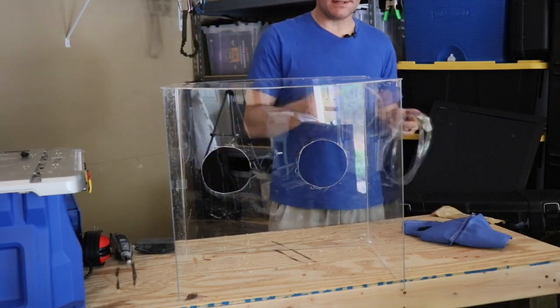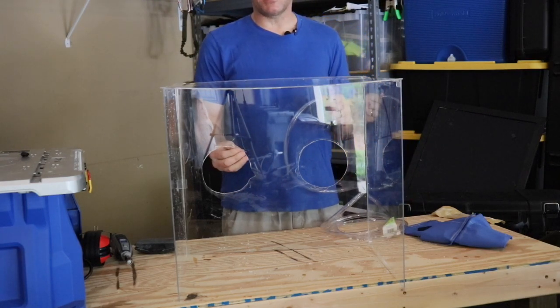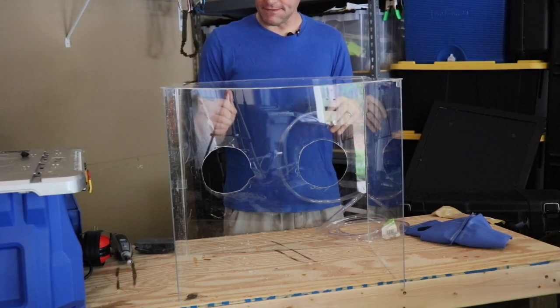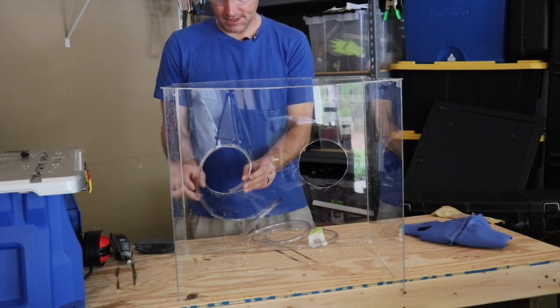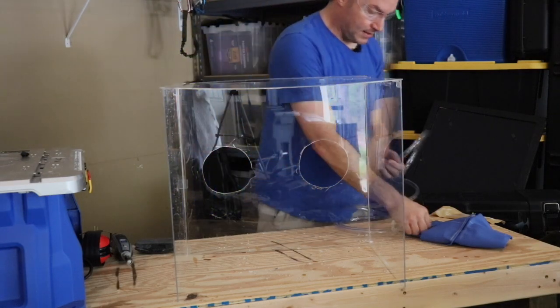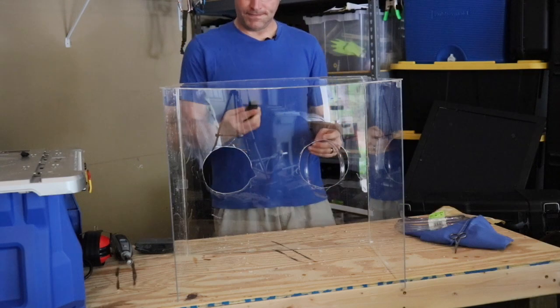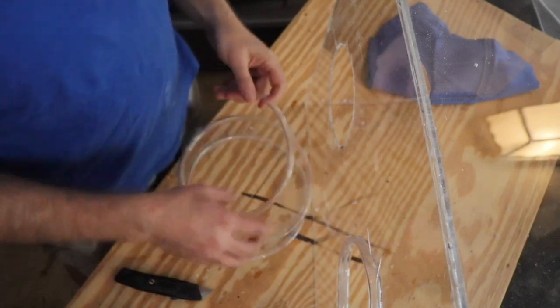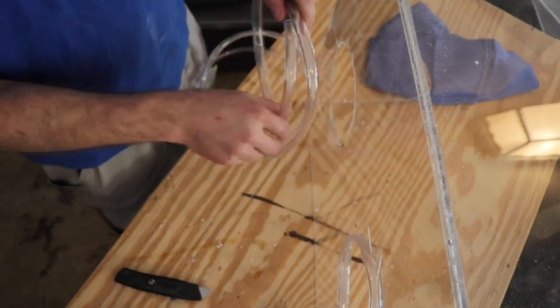But what I'm going to do is I have this little clear hose here. So what I'm thinking is it'll add an extra layer of protection against the arms here, but if we make this right, it'll also be removable so that we can still take this off and use whatever kind of cleaning technique you're going to use. So I'm just going to kind of rough measure this to around the hole because it's flexible. I'll take some scissors here and I'm going to cut it. And then I'm going to take my X-Acto knife and try to split it right down the middle. So now let's do the other side. We're just going to kind of rough fit our tubing here.